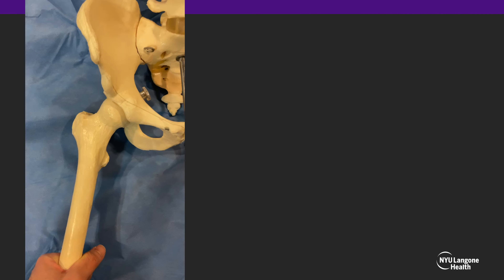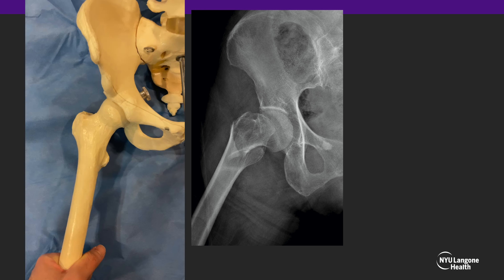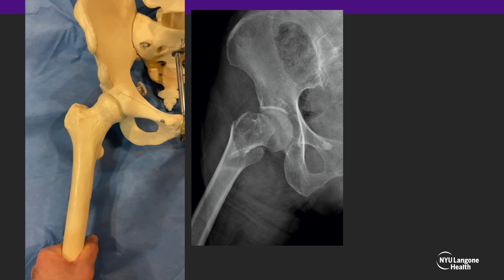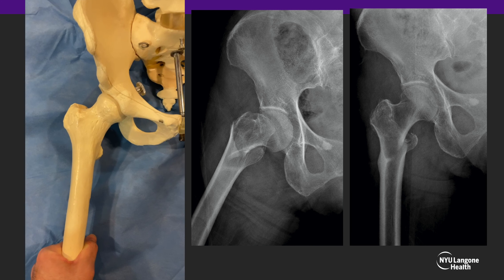Here is another example of the effect of the internal rotation component. Initially, the hip fracture causes the lower extremity to sit shortened and externally rotated as demonstrated here. Once you rotate the lower extremity internally with traction, the fracture better aligns and the proximal femur is presented perpendicular to the x-ray beam.